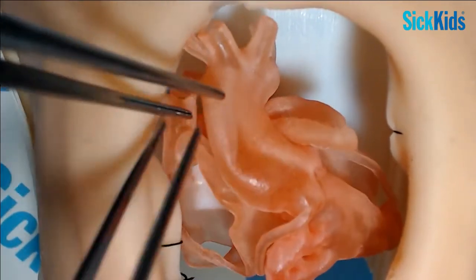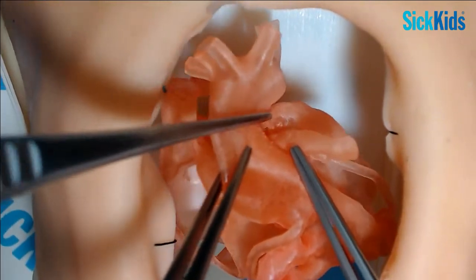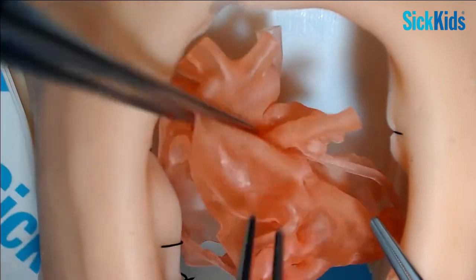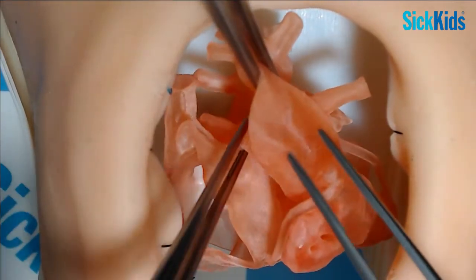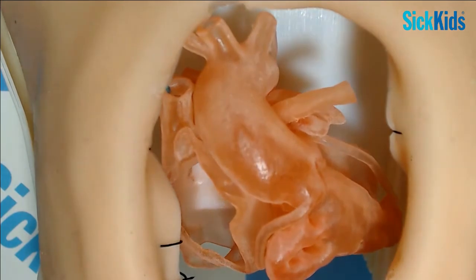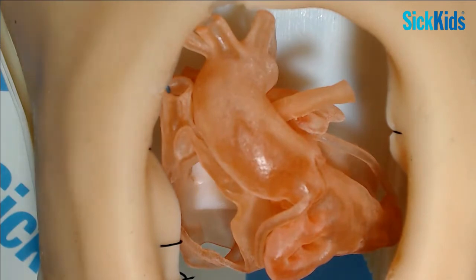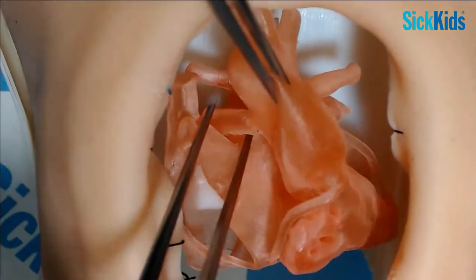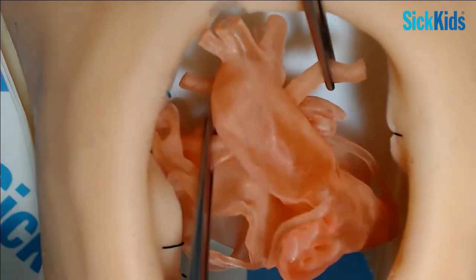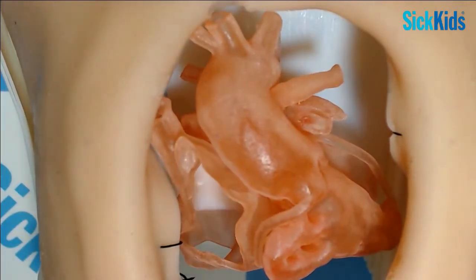So there's a good length to the trunk here, so you've got plenty of room to get a cross clamp on here above the pulmonary arteries. It's not always that you've got as much room. And then how do you control your bypass as soon as you run on bypass? Snare the PAs. You have to have both your pulmonary arteries mobilised and snared, so when you go on bypass you occlude these so that you don't get all the flow running off into the lungs.